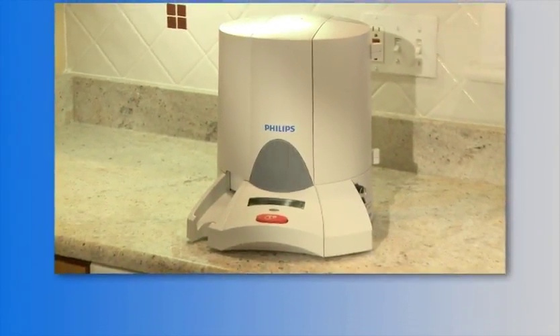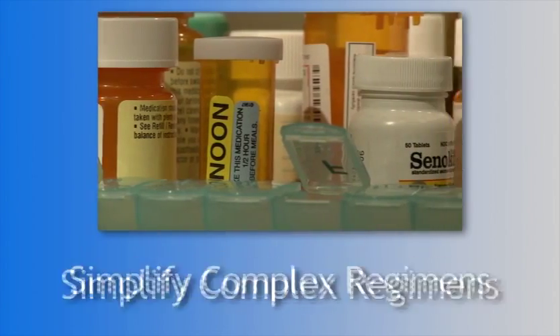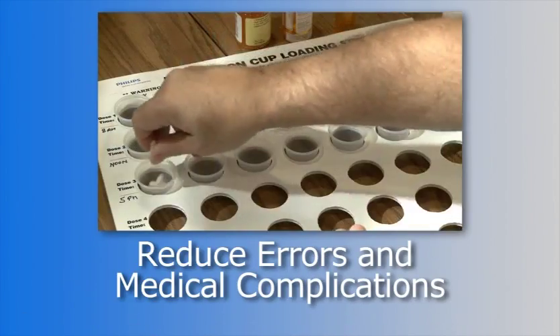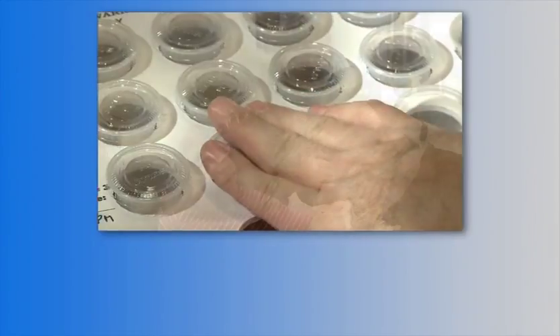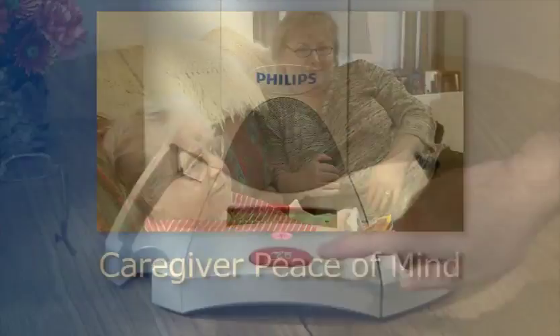The Philips Medication Dispensing Service is designed to simplify complex medication regimens, help reduce errors that can lead to medical complications, and provide both caregivers and patients peace of mind. Here is how it works.